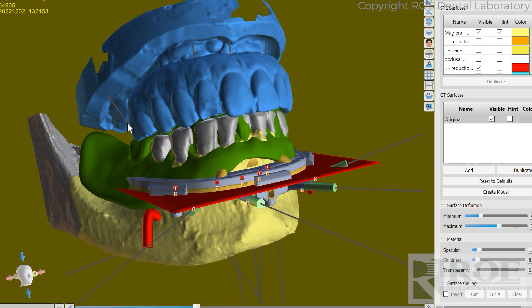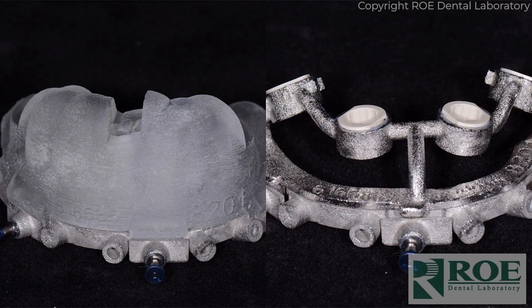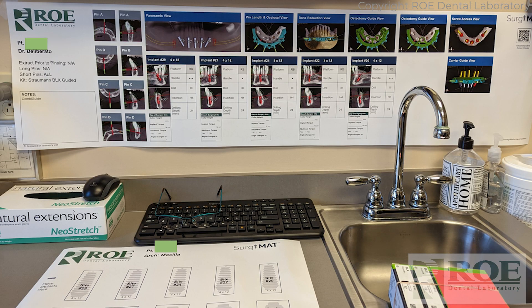Once the case is fully planned, in about eight days we ship it to the doctor — two simple apparatuses: the pin guide, the fixation base three, and the osteotomy guide. On the day of surgery, in this particular case, Dr. Deliberato and Dr. Shapiro ordered the SurgyMat, which normally comes with a chrome case, but it's available as an add-on purchase as well.